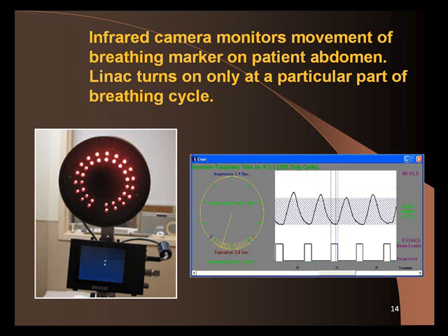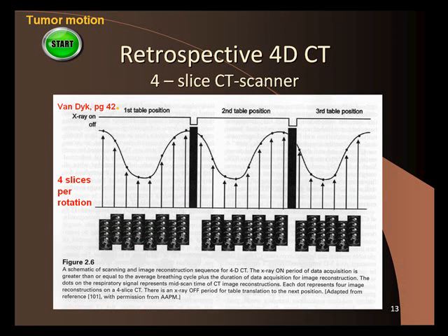So we've got our 4D CT, and we've taken one of these and we said, we want to treat the tumor right at this point right here. So you have an entire CT scan of this point. And actually, that's a really common point to treat, because when the patient exhales, they actually pause for a little bit at the bottom. So it's a good time to treat.